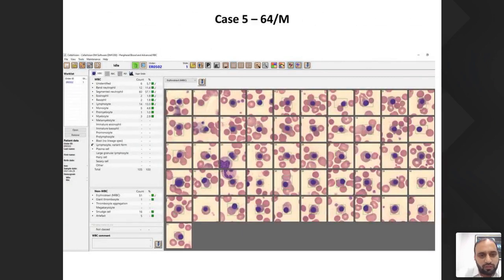So I go into the WBC. Here I would take the opportunity to venture into this WBC tab, which is going to be covered more elaborately in the next session. But a part of RBC, that is nucleated RBC or the erythroblast, are counted in the WBC. So we see that around 51 NRBCs were present in 105 WBCs. And so quantification has been done. I can do a corrected WBC count and I can report it accordingly from here only.